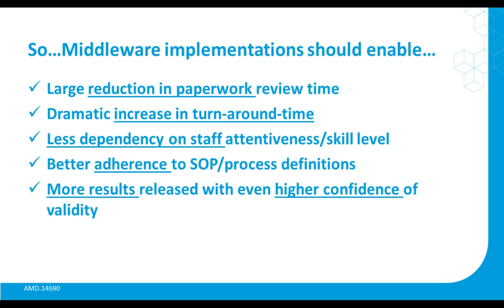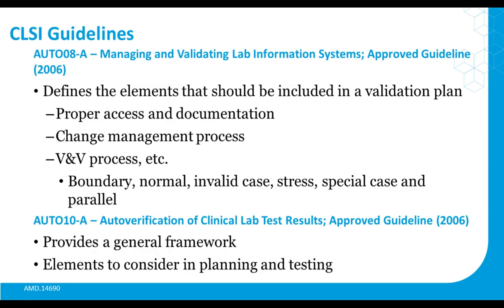Automating things that are normally relegated to a human being who can forget, can get distracted by phone calls. That's what it's all about. At the end of the day, it's about more results released with a higher confidence of their validity.